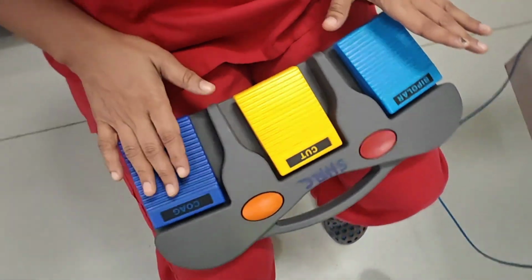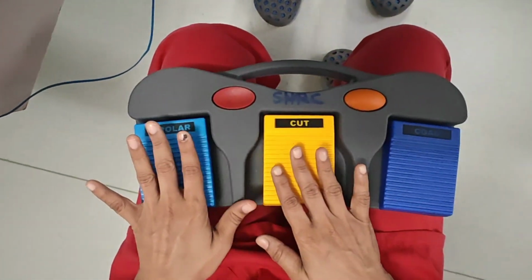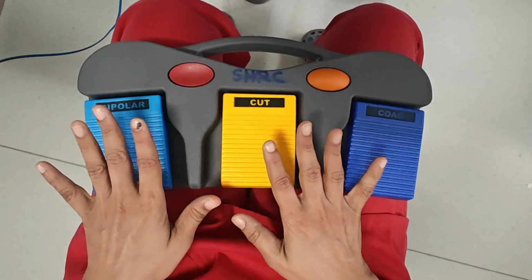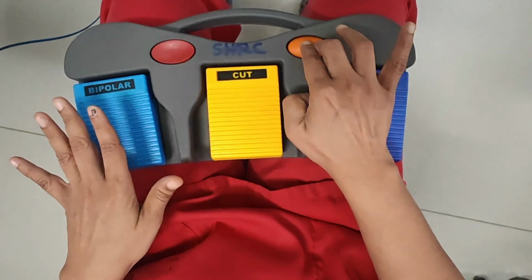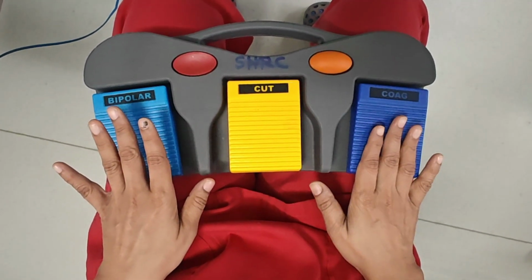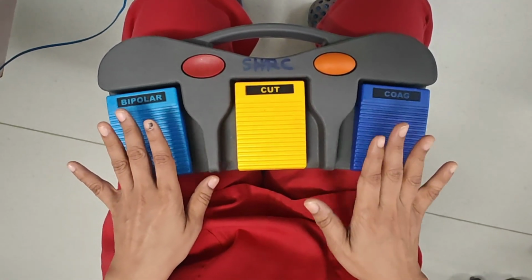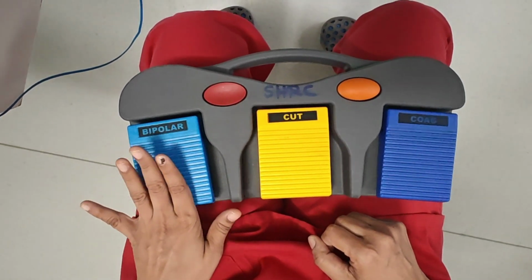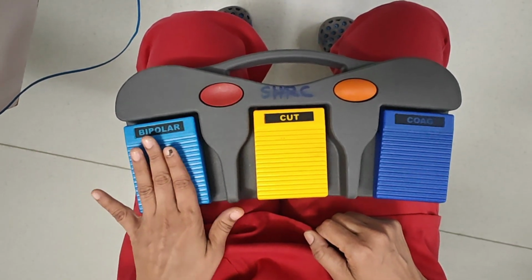So this is the foot pedal which I am showing you. The foot pedal has 3, that is the bipolar, cut and the coagulate. The bipolar, what is written here, is mainly for vessel sealing. The cut and the coagulation can be for both bipolar and monopolar. So this orange button, if I press, will shift over from the bipolar to monopolar. When I press the coag, it just coagulates the tissue, and if I press this bipolar, it is mainly for vessel sealing.